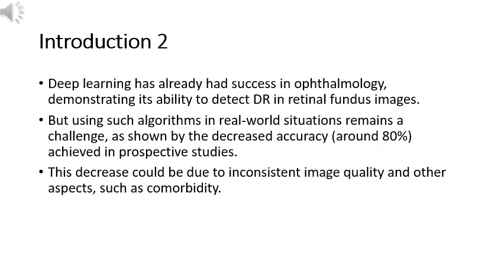Deep learning has already had success in ophthalmology, demonstrating its ability to detect DR in retinal fundus images. 14, 17 In fact, previous studies report accuracy of over 90% with sensitivity and specificity levels over 90% as well, which coincides with roughly the same level as a human ophthalmology expert.